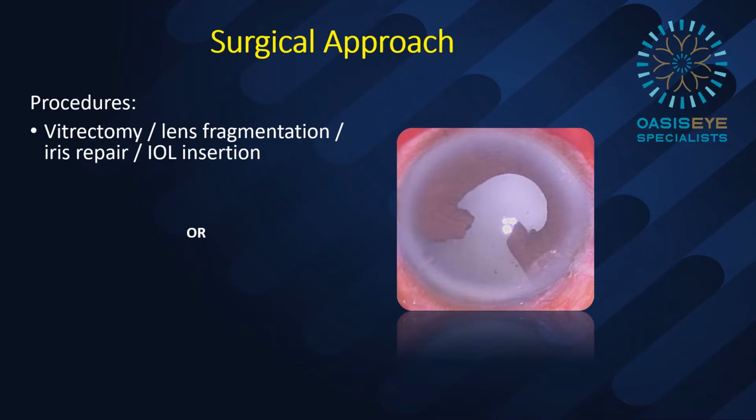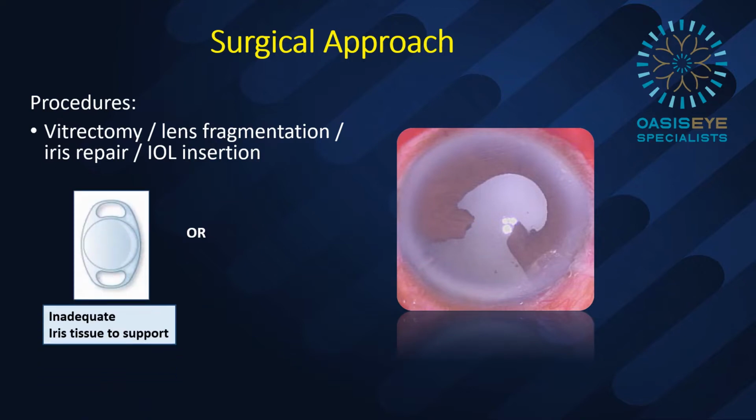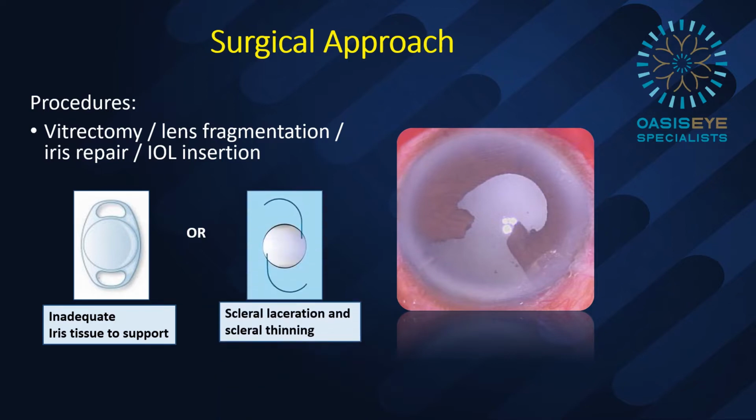How do you approach this case? So far, the first goal here is to do the vitrectomy lens fragmentation for dislocated lens. Second goal is to perform iridodialysis repair and pupilloplastic repair and insert the intraocular lens. Do you prefer iris claw lens but concerned about inadequate iris tissue to support, or do you prefer sclera fixation lens in the post-sclera repair and sclera thinning eye?